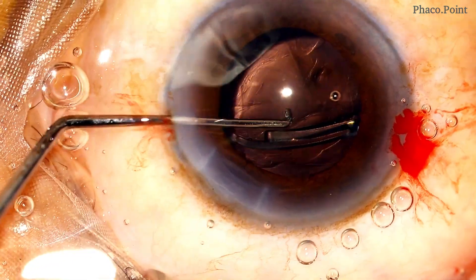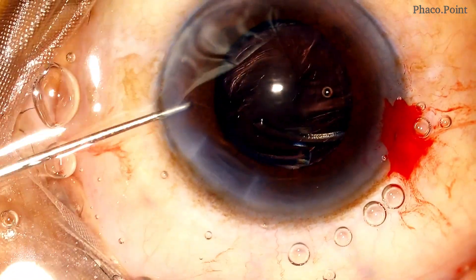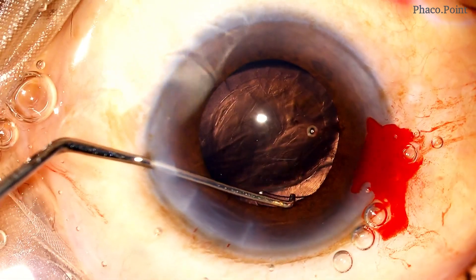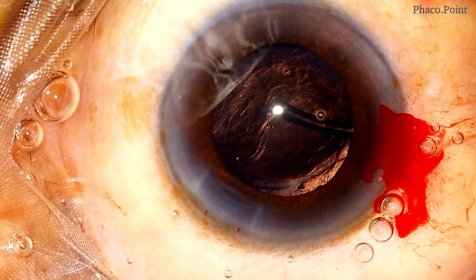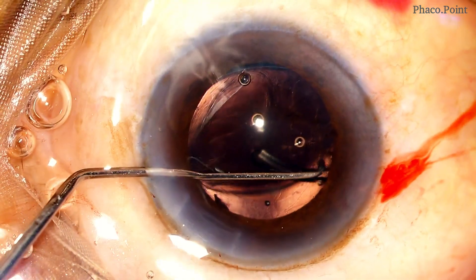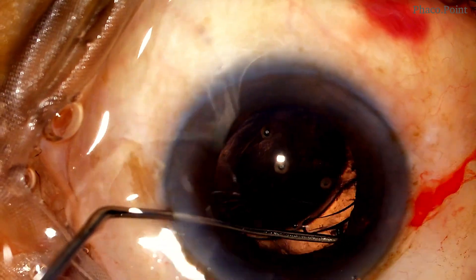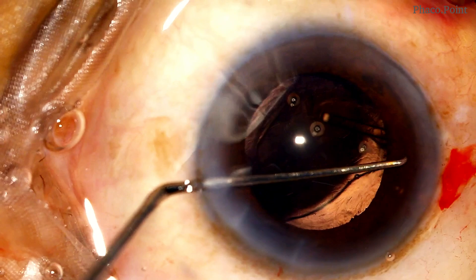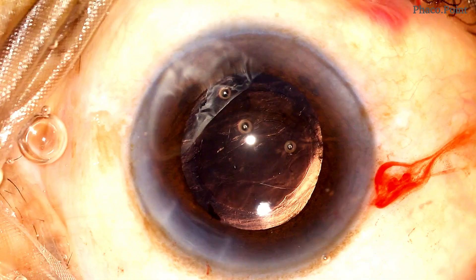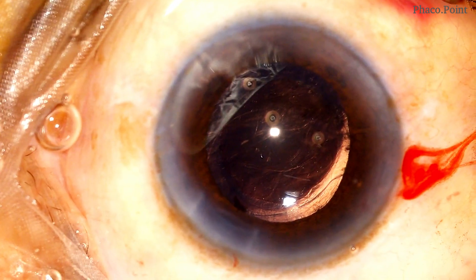In this case, both haptics appear slightly stuck to each other and it may take a few moments or even a couple of minutes to get unhinged. I soon realize that the superior haptic is twisted and is actually outside the capsular bag. Note how with the Sinski hook it is brought inwards, untwisted, and encouraged to take its proper orientation in the capsular bag. We now have a monofocal IOL well centered within the capsular bag despite the presence of a punched-out posterior capsular rupture behind it.